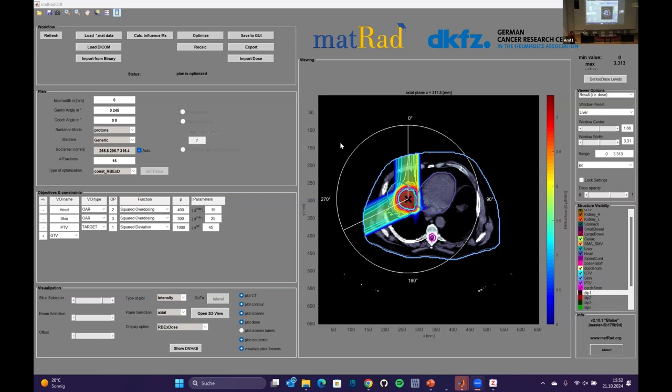It also seems to be a theme that tweaking seems to be less required for protons, because due to the geometry of patients and deep-seated tumors, and due to the characteristics that the dose in depth is naturally high at the distal edge where the tumor is, you already just get much nicer doses to begin with.